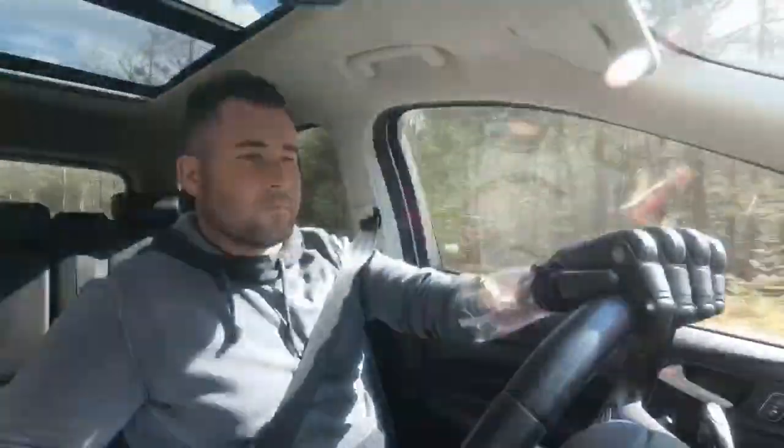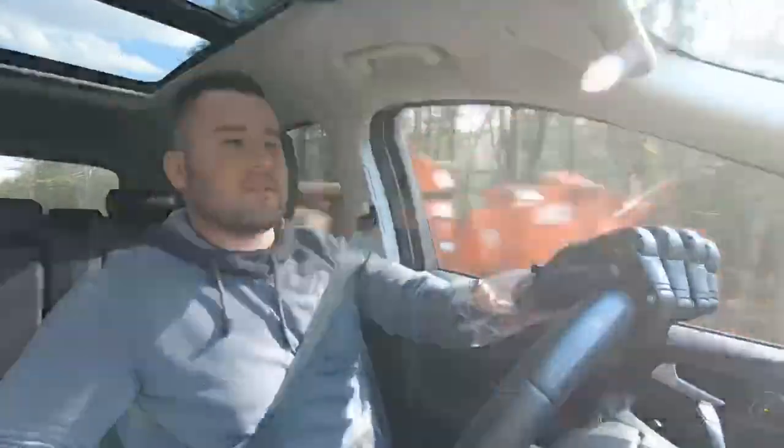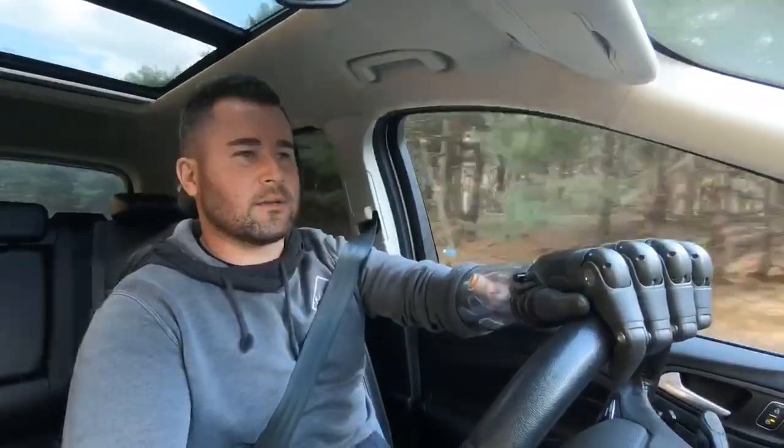I just got out of work — thankfully I'm still working with everything going on in the world right now. Anyway, this is a Tasca hand. It's a relatively new hand, been out for about a year. It's a multi-articulating hand, meaning all five fingers move. They're not all independently controlled, but there are different grip patterns that allow different hand gestures and grips to pick up different shaped objects.